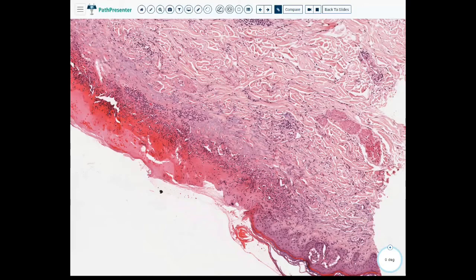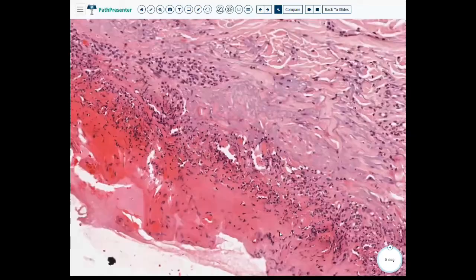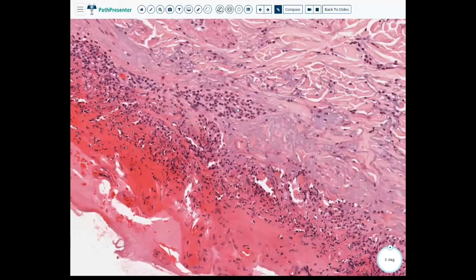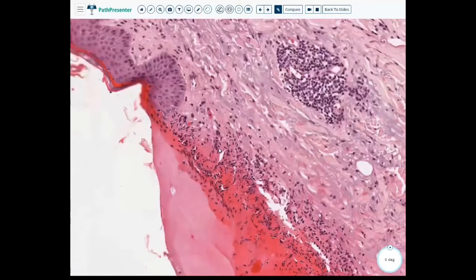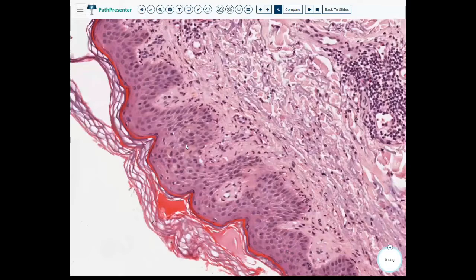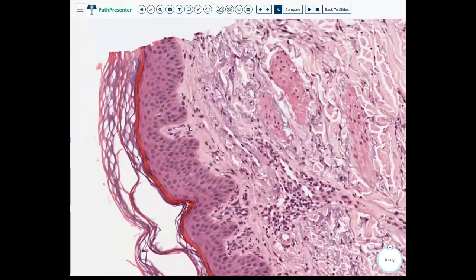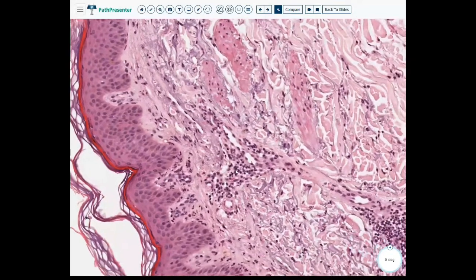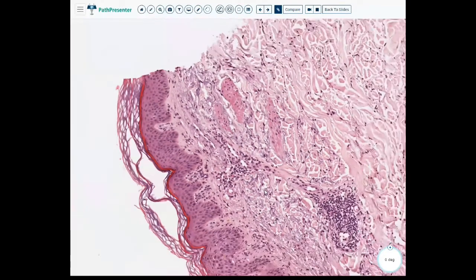So we definitely have neutrophils. Look at all the little ants in there. Much easier to see on this case than the previous two. We do have, what else? This doesn't look terribly acanthotic. The keratin layer actually looks relatively okay. We do have lymphocytes. I do see some eos in there. And there is, again, the solar elastosis to the superficial dermis.